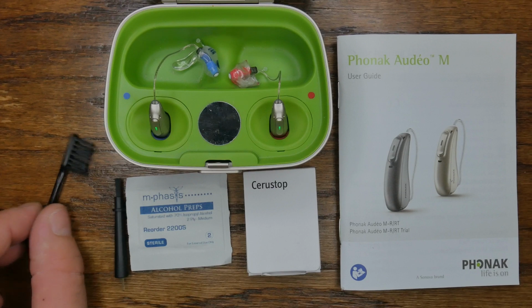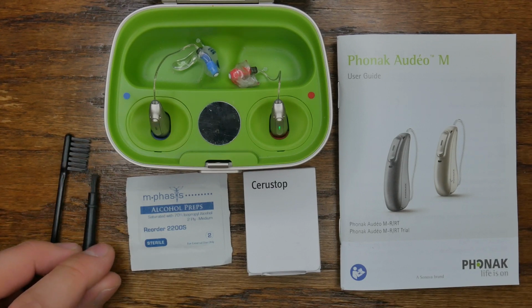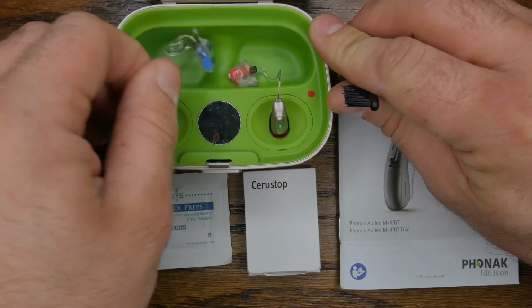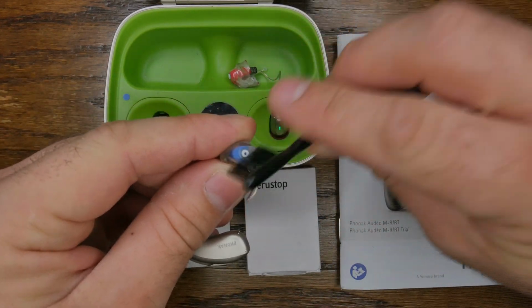When cleaning your hearing aid, you want to use a brush of some kind to gently remove cerumen and other debris from the hearing aid earpiece as well as the main body of the hearing aid. This is best accomplished when taking the devices out of your ear at the end of the day before putting them on for charge.